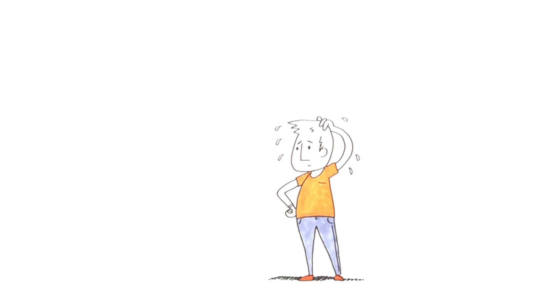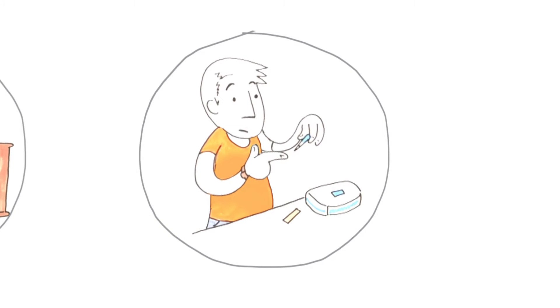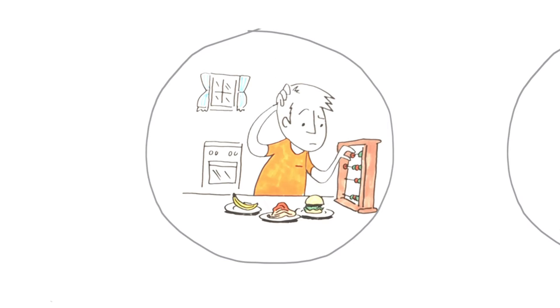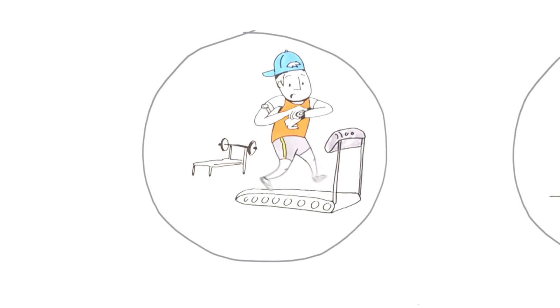Life with diabetes can be challenging. There are blood sugars to track, carbs to count, exercise to monitor.